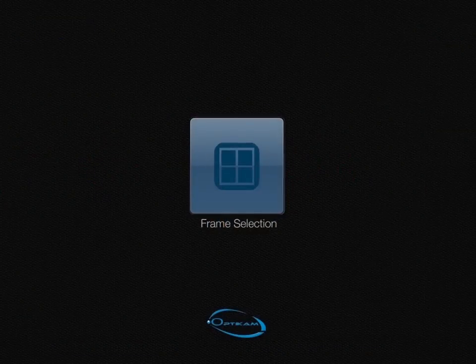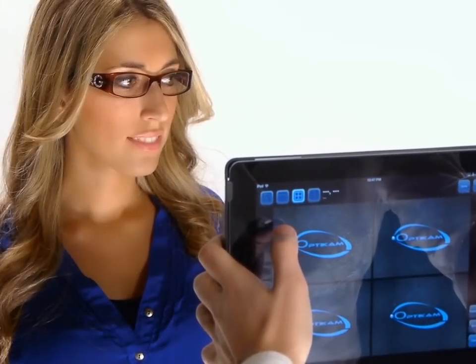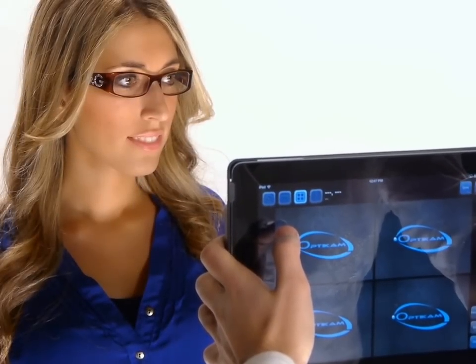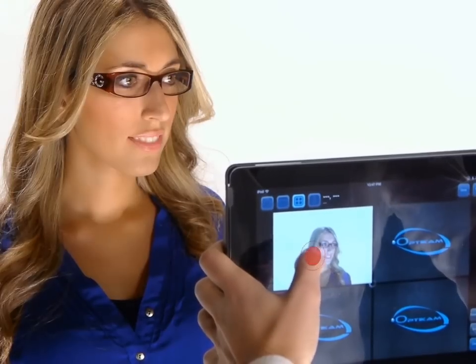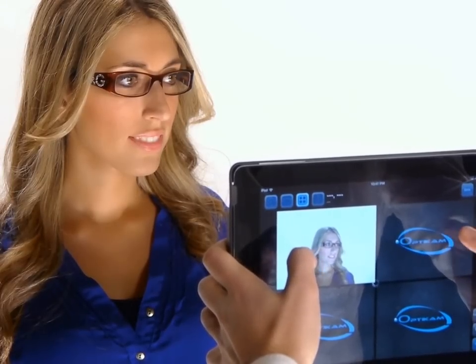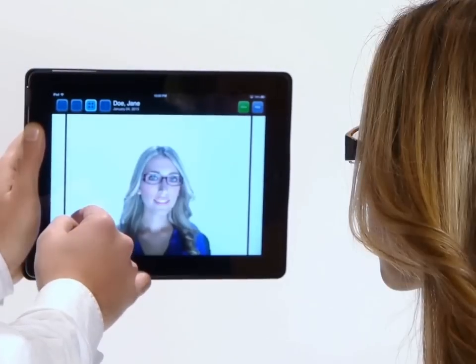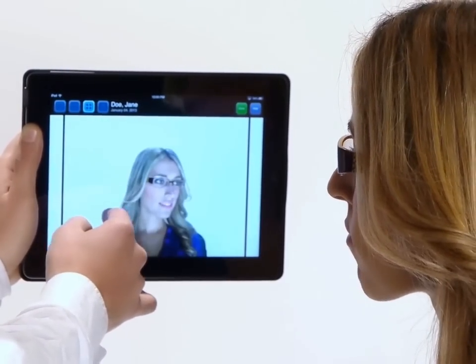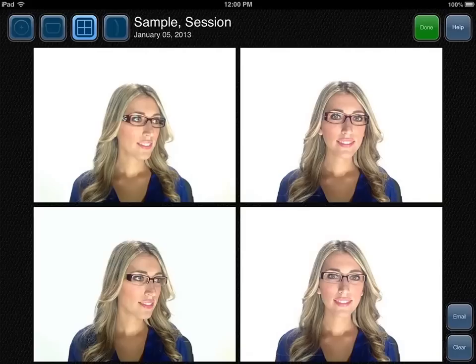The Frame Selection module enables customers to see how they look in different eyewear. The side-by-side image comparison exposes the customer to frames of different styles, resulting in an increase in multiple frame sales. You can email customers their pictures by touching the email button located at the bottom right-hand side of the screen.